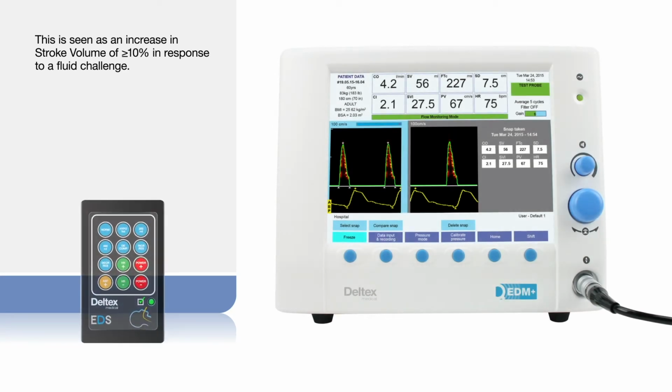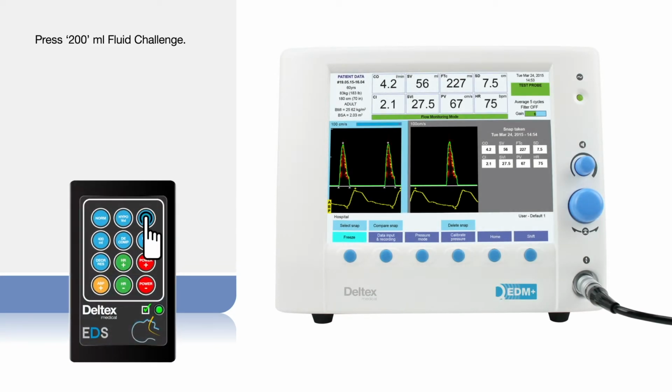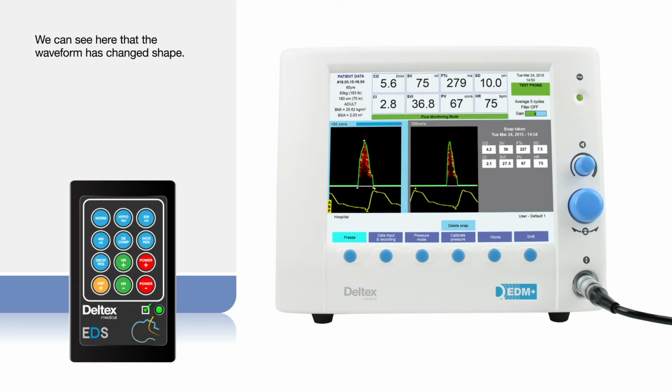On the simulator pad, press 200 ml fluid challenge. We can see here that the waveform has changed shape. The stroke volume has increased by over 30%, indicating that more fluid may be required.